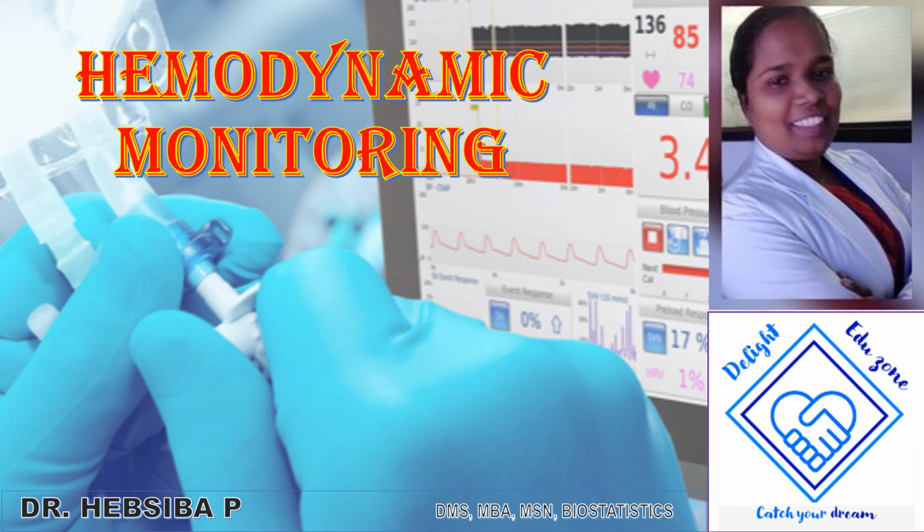Hi all. In this section, I will teach you about hemodynamic monitoring. As you all know, hemodynamic monitoring is a process of analyzing cardiac function by certain invasive procedures. Those procedures are intra-arterial blood pressure monitoring, central venous pressure monitoring, and pulmonary capillary wedge pressure monitoring. We can see more detail about that.